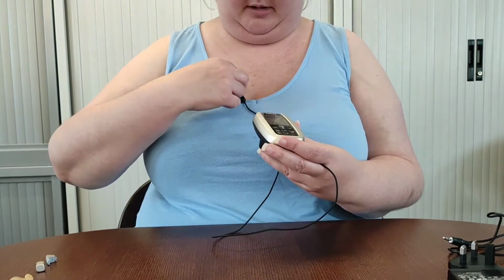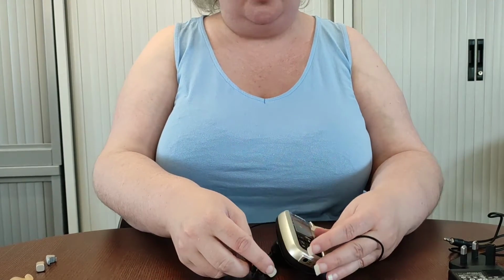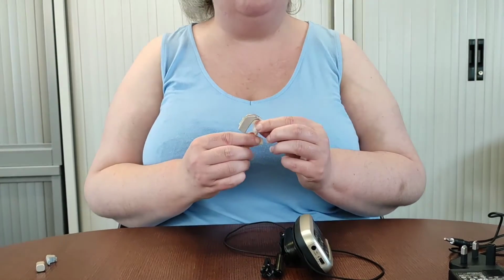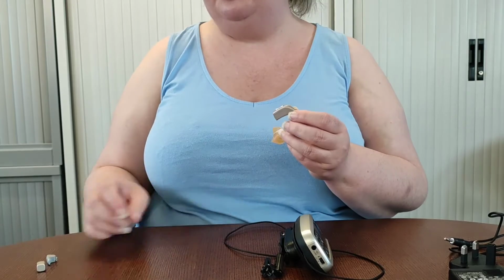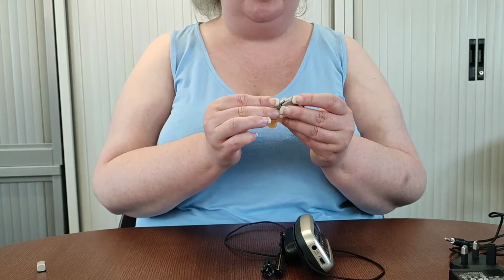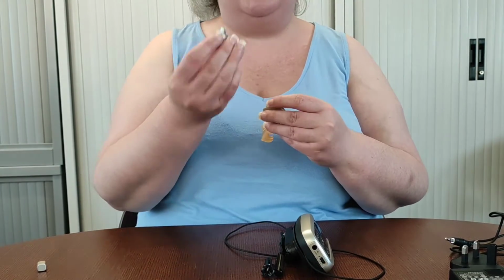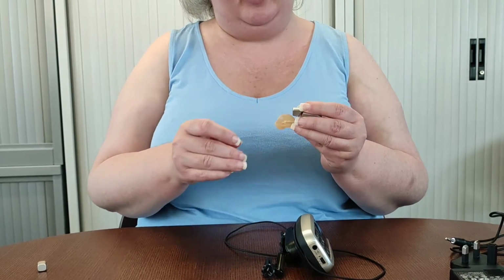So I'm going to unclip that for now. I'm going to talk about some of the other elements that we need for this to work. So we have our hearing aid as an example. It might be a different listening device, but for this example I'm going to use a hearing aid. It will have a shoe, an audio shoe, attached to the bottom. This may be part of the battery compartment and built in, or it may be like this where it's an additional part that would slide onto the bottom of the hearing aid.